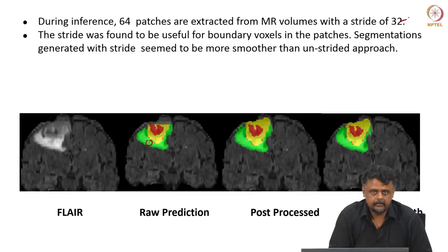So that concludes our case study. We were looking at using convolutional neural networks for analyzing medical images, specifically to segment brain tumors from MR volumes. A particularly challenging problem, since brain tumor is diffuse, there are no clear-cut boundaries in many cases, and the problem also involves segmenting subclasses from the tumor, which are again not that well defined in many cases.